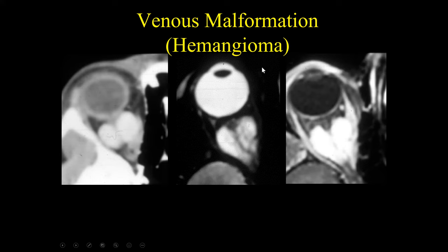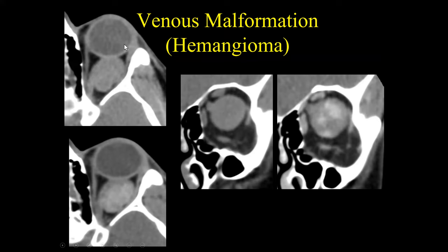This is an example of a venous malformation. Historically we called these cavernous hemangiomas — a diffusely enhancing mass, high signal on T2, homogeneous enhancement with contrast. We now tend not to use the term cavernous hemangioma; instead we use venous malformation. What we specifically look for is delayed enhancement. These venous malformations — formerly called cavernous hemangiomas — were the most common retrobulbar masses in people under 40. The way we can make the diagnosis is to look for that delayed enhancement on CT or MR.